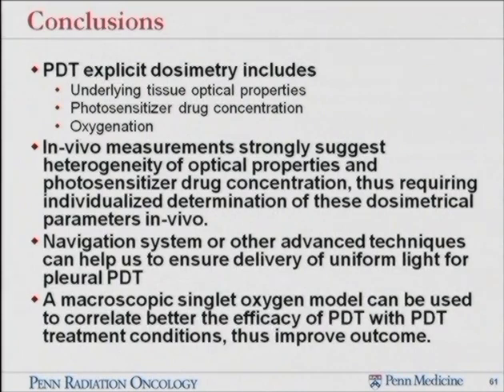In vivo study strongly suggests that heterogeneity of optical properties and sensitizer concentration requires individualized determination of these quantities, at least one way using the navigation system, which will allow us to deliver uniform light distribution. Some of the modeling methods will complement this technique and tie up all these quantities together.